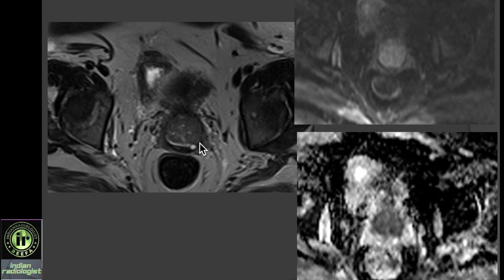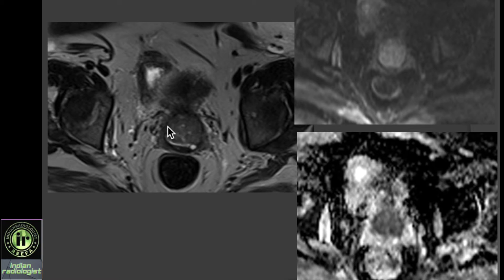This is just to show a tumor in the cervix, which on T2 is heterogeneous and slightly hyperintense, and demonstrates restricted diffusion.